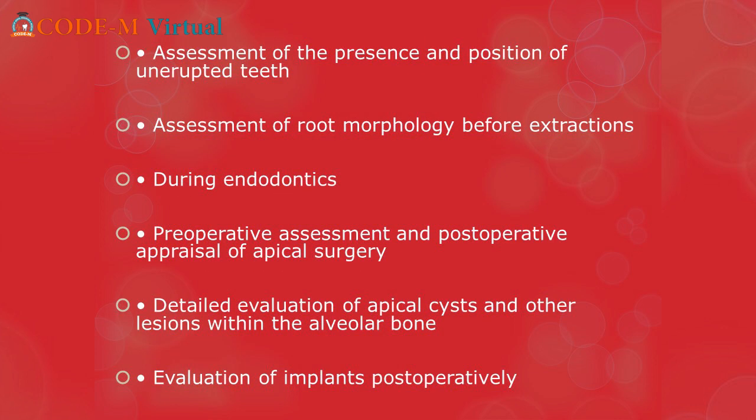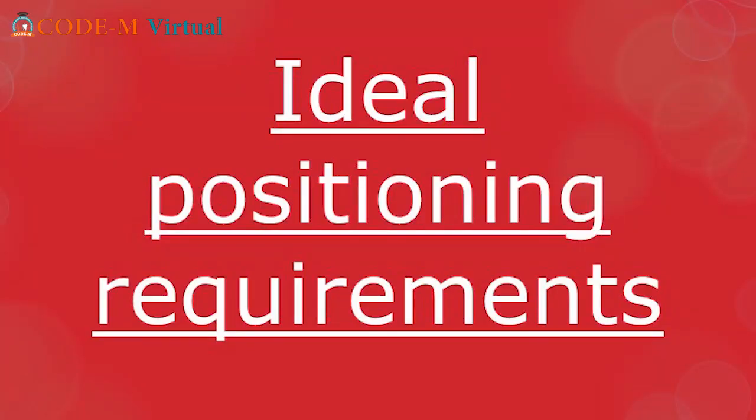assessment of the presence and position of unerupted teeth, assessment of root morphology before extractions, during endodontics, pre-operative assessment and post-operative appraisal of apical surgery, detailed evaluation of apical cysts and other lesions within the alveolar bone, and evaluation of implants post-operatively. Now we come to the ideal positioning requirements of a periapical radiograph.